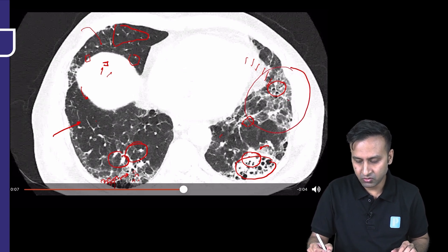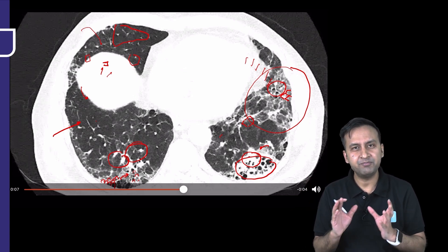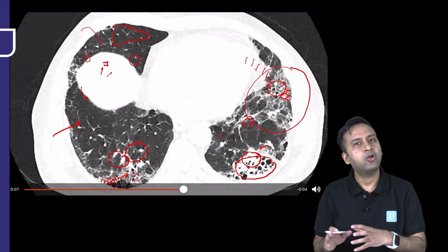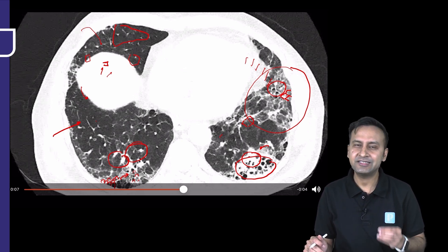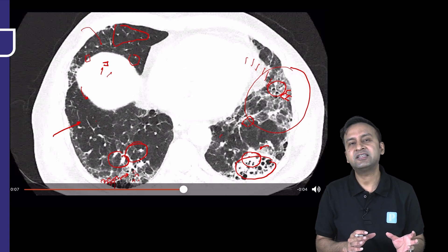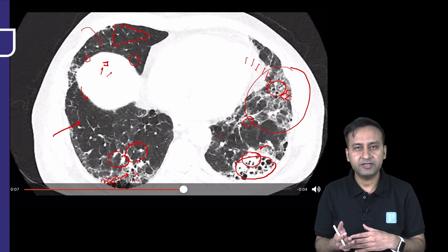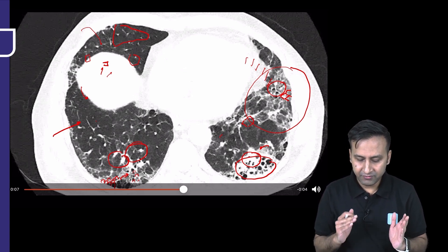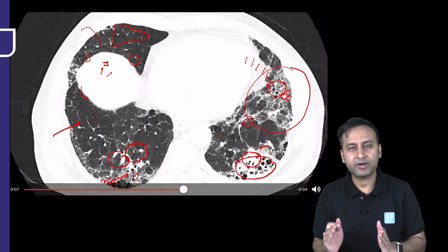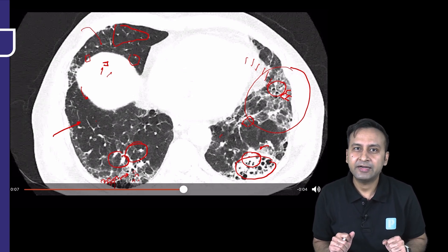We can also see ground glass opacities and interlobular and intralobular septal thickening. With all these observations made, almost half the work is done. The list of differentials in ILDs is very small — you characterize ILDs into various patterns and the rest is clinical integration. Now that we've looked at the case in totality, let's look at a few important representative images and discuss the key findings once again.